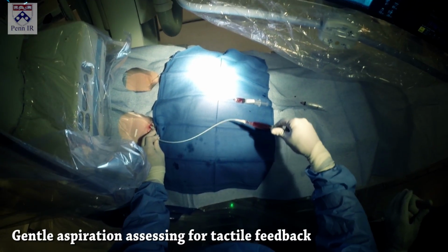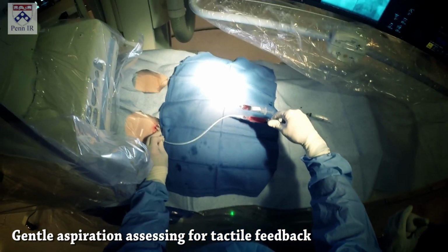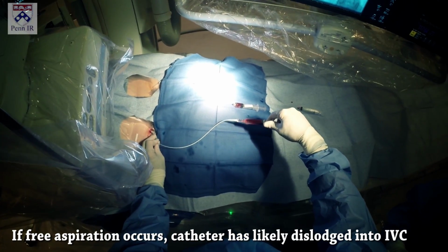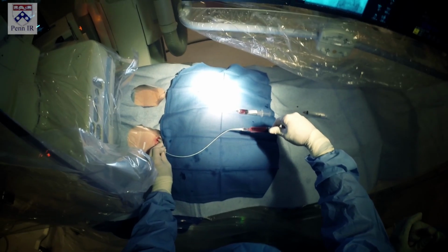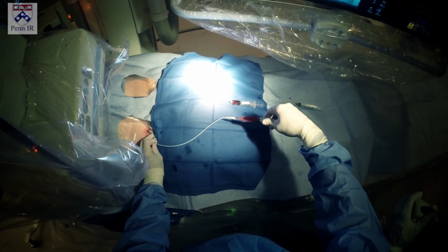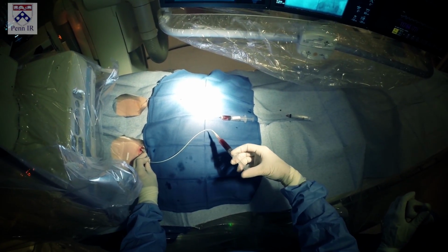You want to make sure that you're looking for that tactile feedback and that it's not coming freely. If it's coming freely, then you've fallen out into the IVC. Typically, you'll get what I call chattering, where the tip of the catheter is kind of banging up against the vein as it collapses and then fills, and collapses and fills, and it gives a chattering sensation.